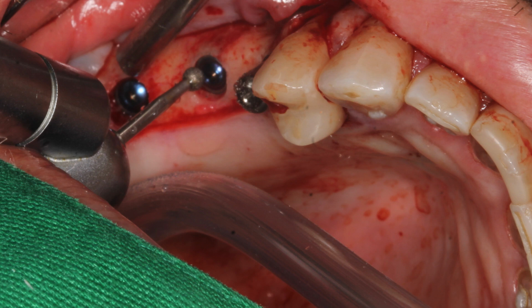So what do we do with these uneven surfaces? And here Dr. O'Brien is actually using a freehand technique, a coarse diamond surgical burr with copious irrigation to shape the bone, and in order to not inadvertently touch the implant connection surface, he's placed cover screws in there to protect that. Now, of course, after making Dr. O'Brien try with sweat pouring out, we said enough of this tribulation, let's actually use an easier technique.